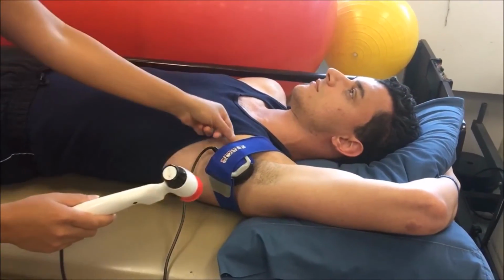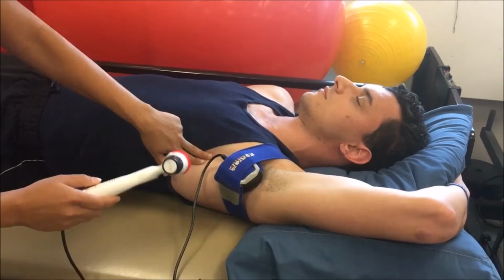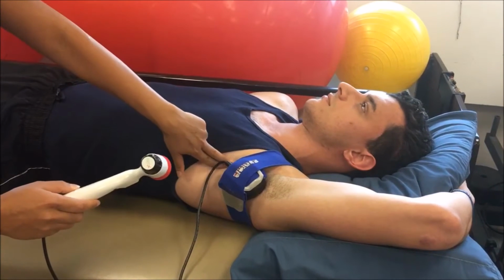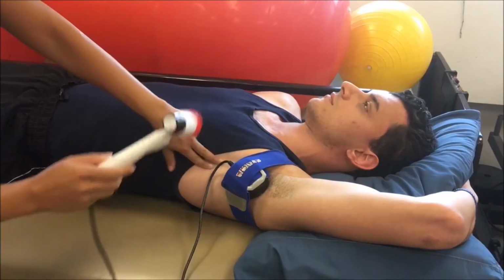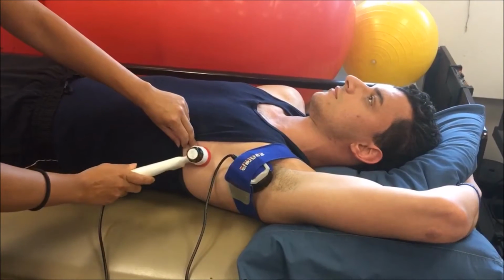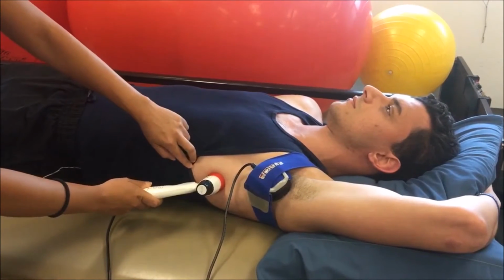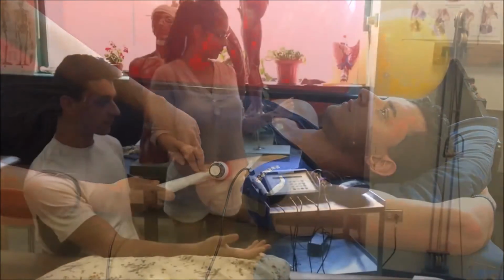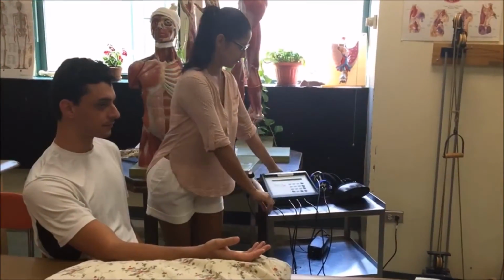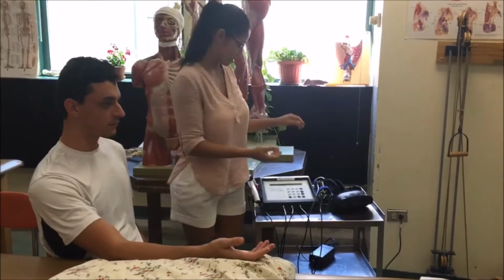For the treatment of lymphedema, we can place the SLD under the axilla, and we are going to treat the lymph nodes under the axilla with the laser, and we are going to follow the path of the lymph nodes along this area. Now I'm going to demonstrate placement of laser and SLD for treatment of carpal tunnel syndrome.